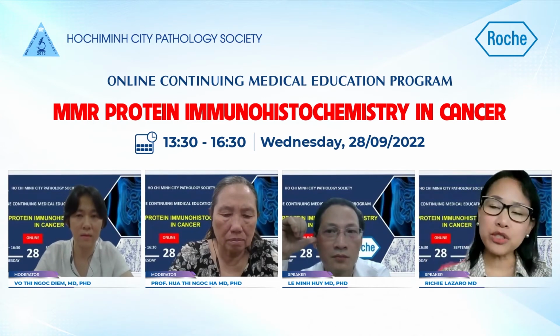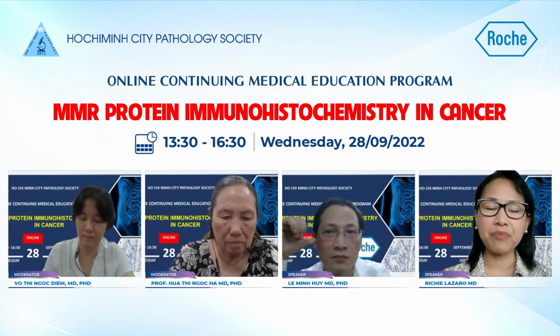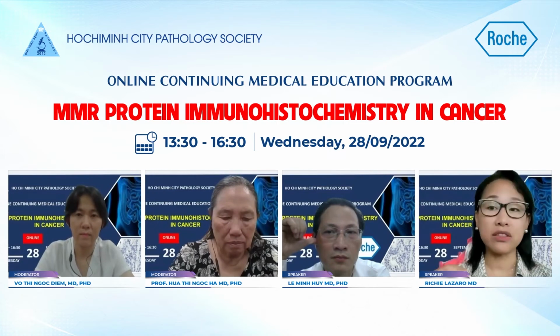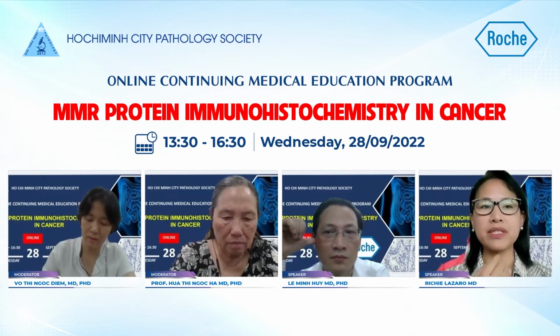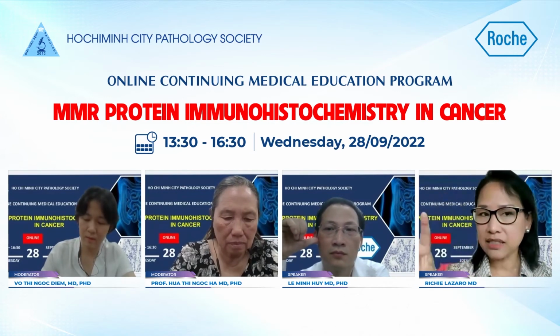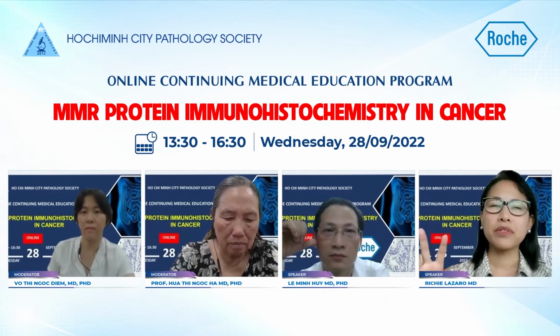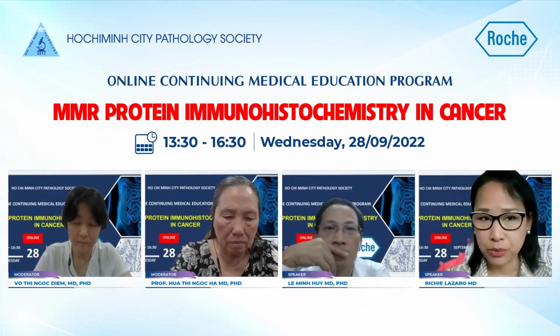So it was mentioned in my talk, as per interpretation guide, if it is focal staining and we do not have a cutoff in our interpretation guide, whether it's 10%, 5%, but it is intact in expression in an area of the tumor, by interpretation, we still call it intact expression.